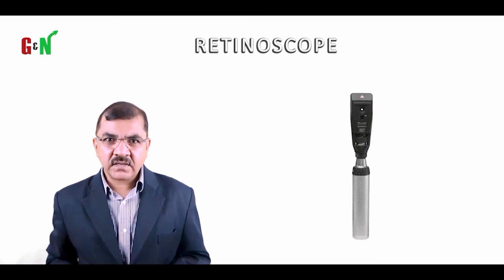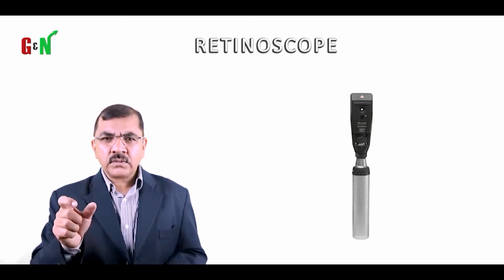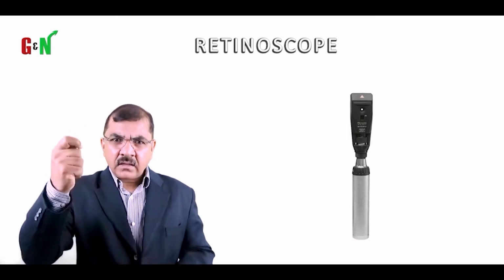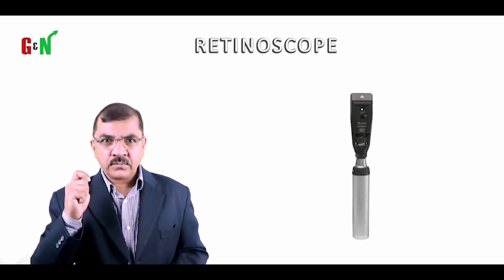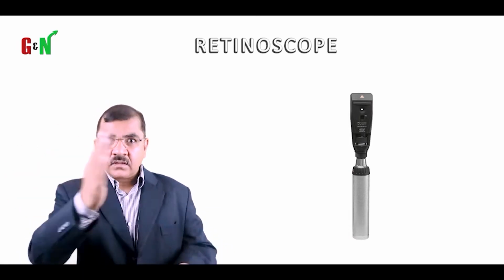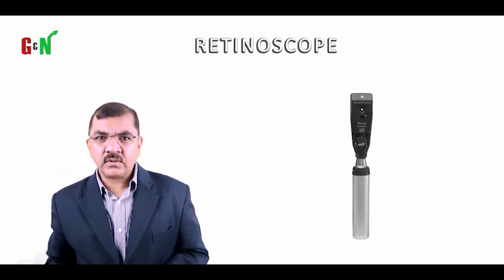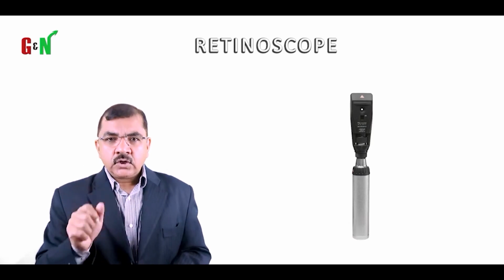There is a reflex inside the eye. The optometrist knows how to do it. But all you need to do is identify that the stick the optometrist carries in his hand is a retinoscope. Because of the image which forms on the retina, through the reflex, they will be able to identify what the power is. So this is the retinoscope.